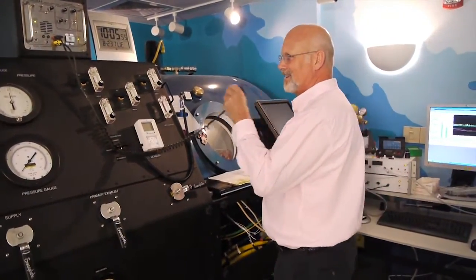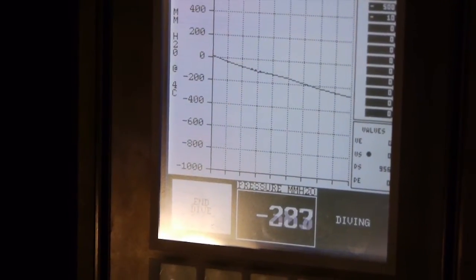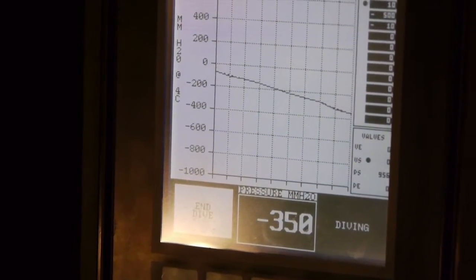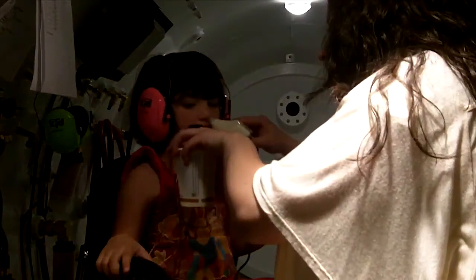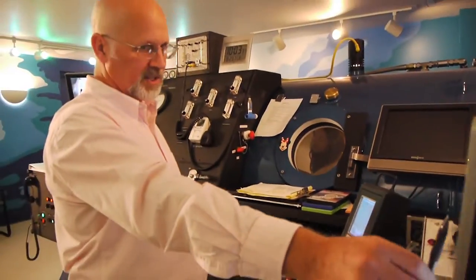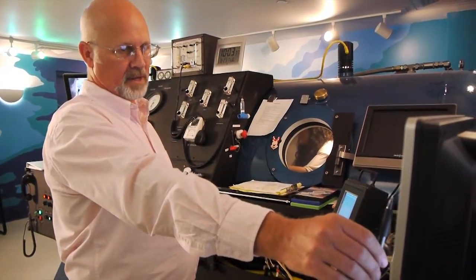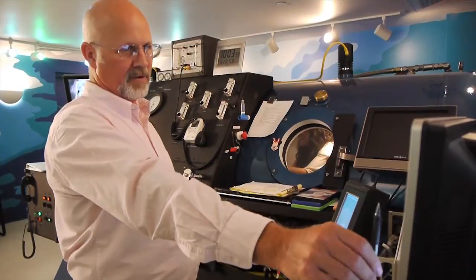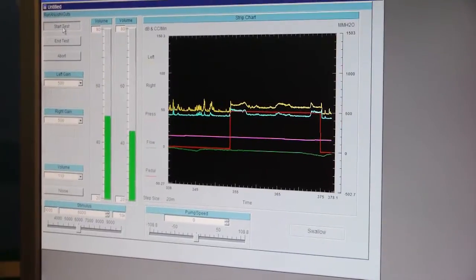The testing we do in the pressure chamber involves stressing the eustachian tube a little bit. The way we do that is we apply pressure to the middle ear — and actually to the entire body — by being in the pressure chamber, or we decrease the pressure around the person and then ask them to swallow. What you're going to see is microphones placed in her ears, covered with ear muffs, and then we put sound in her nose, and you'll see the change in the sound levels on the screen.